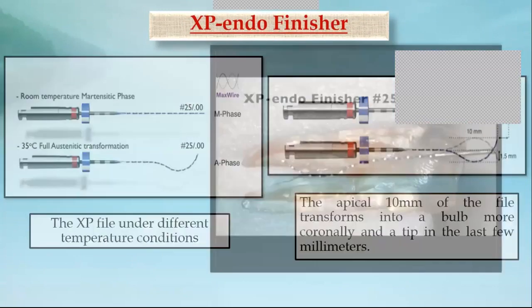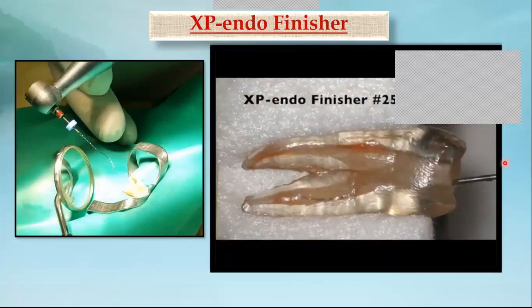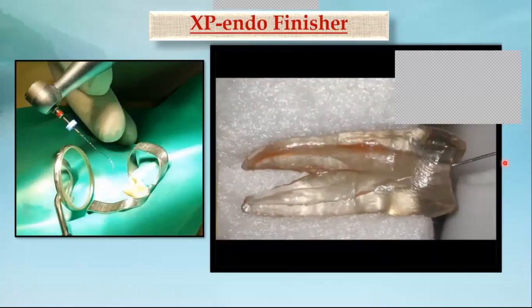Upon spinning inside the root canal, it becomes highly flexible and expands up to 3 millimeters inside the major diameter, the buccolingual diameter of the root canal. The 0% taper makes it highly flexible and highly resistant to fatigue and separation. It causes turbulence of the irrigant inside the root canal that enhances the antibacterial efficacy of these irrigants and disinfection of the root canal.